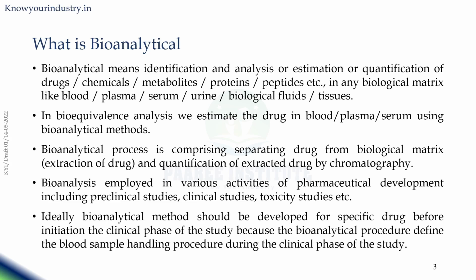Ideally, bioanalytical methods should be developed for the specific drug before initiation of the clinical phase of the study, because the bioanalytical procedure defines the blood sample handling procedure during the clinical phase of the study. So we have to ensure that the bioanalytical method is developed and validated before the start of the clinical phase.